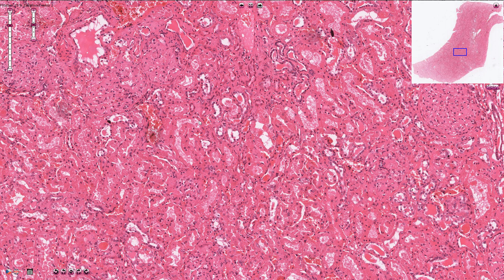Here we have proximal tubules. These are actually distal tubules, and we can also see the blood vessels lined by endothelial cells and filled with erythrocytes.